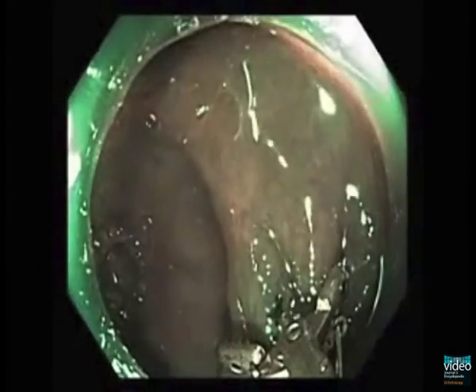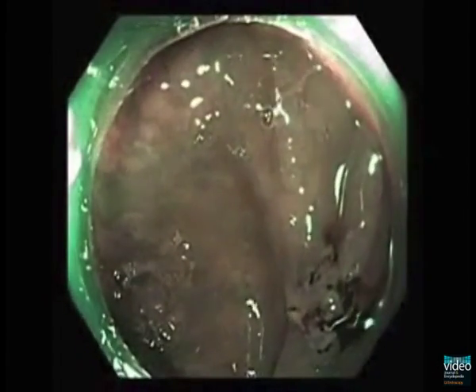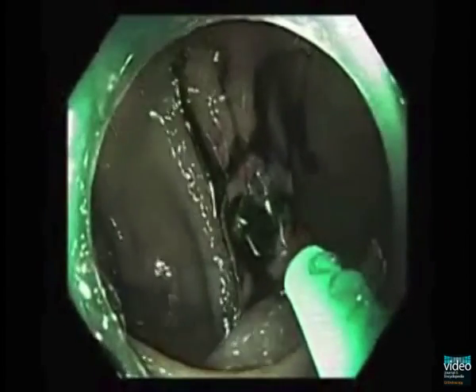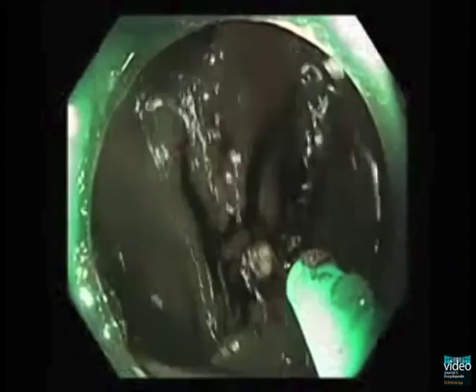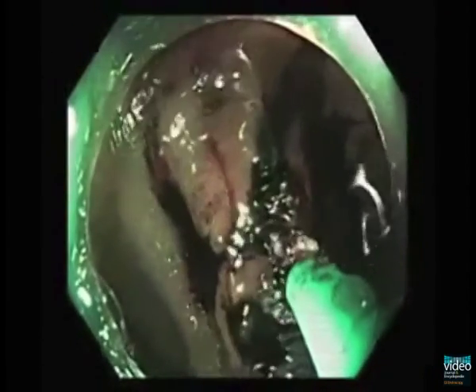There are areas of very dark and thickened epithelium, which in this case were highly suspicious for residual adenoma. As part of an ongoing study, we confirmed these sites with biopsy and then performed ablation or resection. In this case, because of the adjacent scar tissue, further resection was not feasible, so we simply ablated the site using argon plasma coagulation.